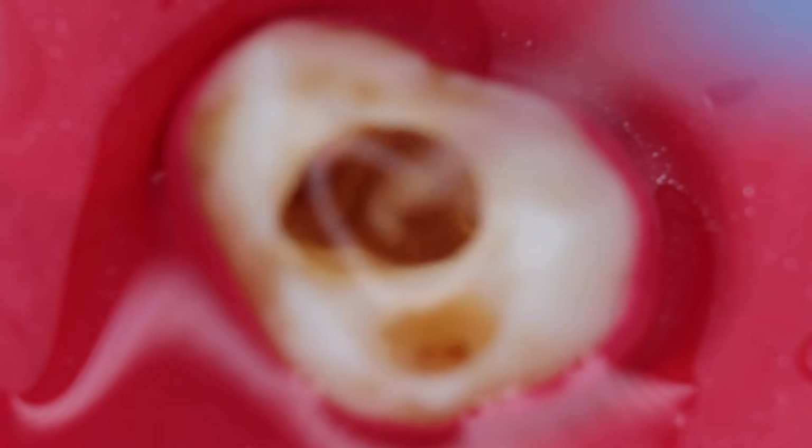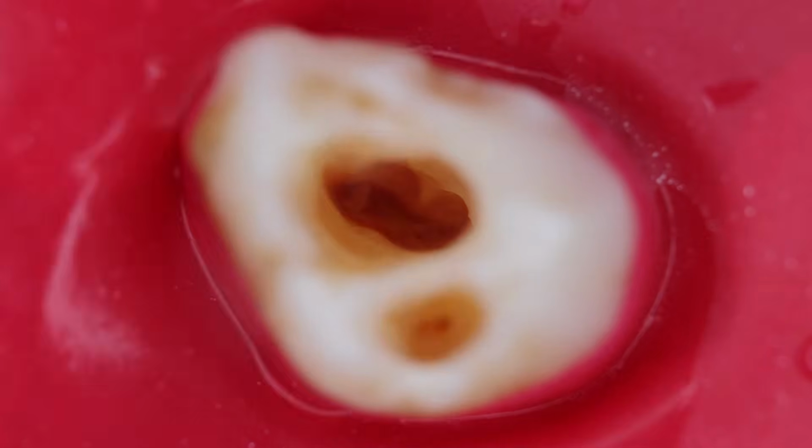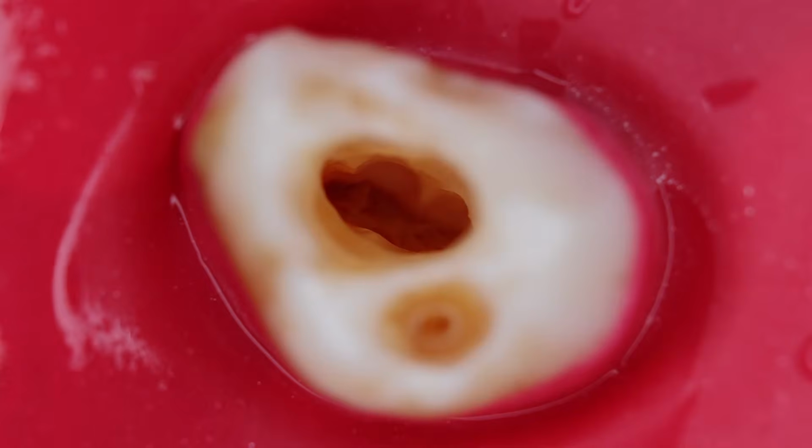Just irrigate the chamber so that you can visually see the orifices.